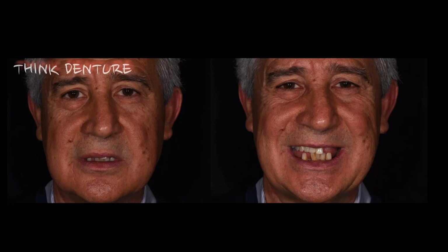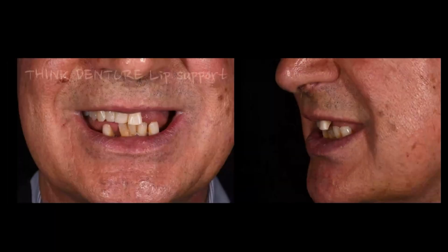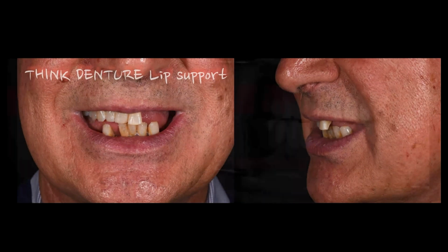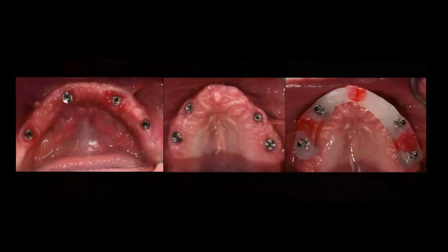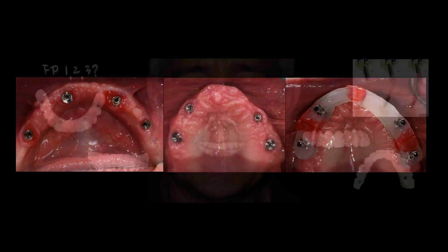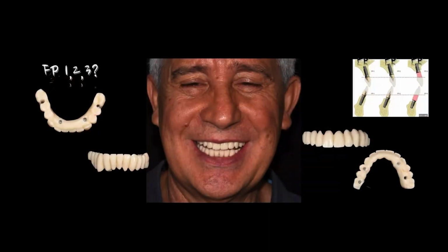So in this particular case, same as always, where does the incisal edge belong? Then we look at the horizontal plane and all the other aspects of it. We also want to support his lip. You'll notice that the lip kind of has a little bit of a flat, sunken area in here. So we're going to try to improve that. And the way we're going to do it is what we would normally do. This would be an all-on case, so those 4 implants are placed. In my normal procedure, I'll do an implant verification jig, custom tray, and then we'll come back and try to make a decision on what he really needs.